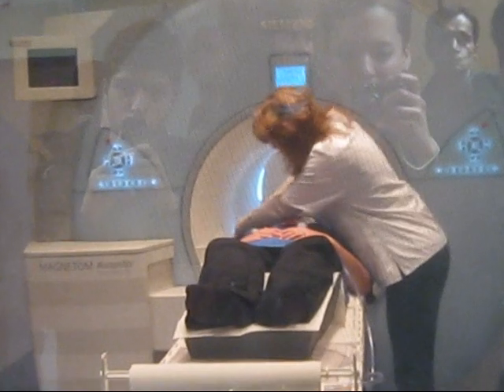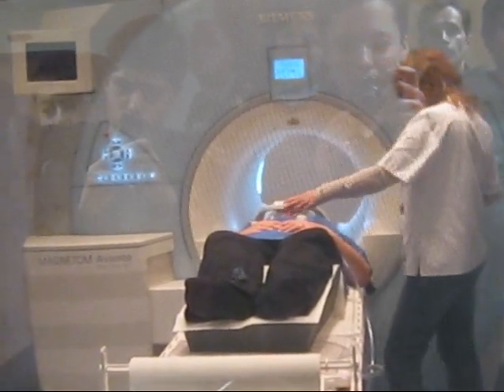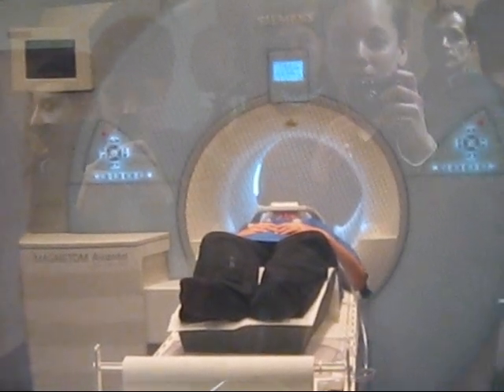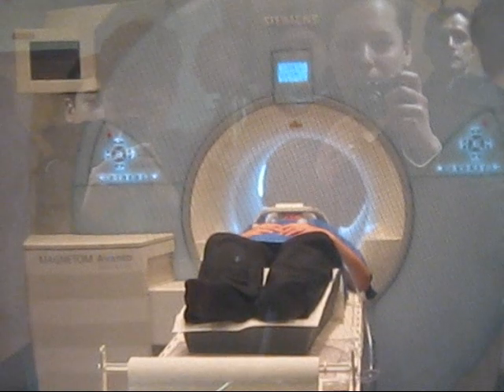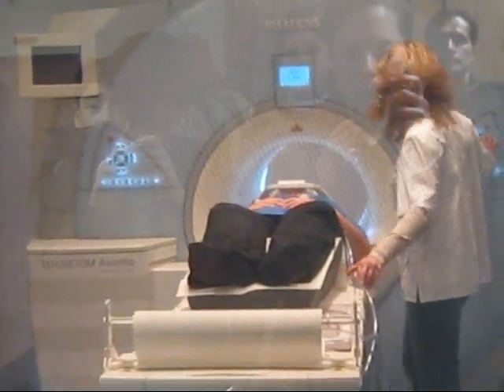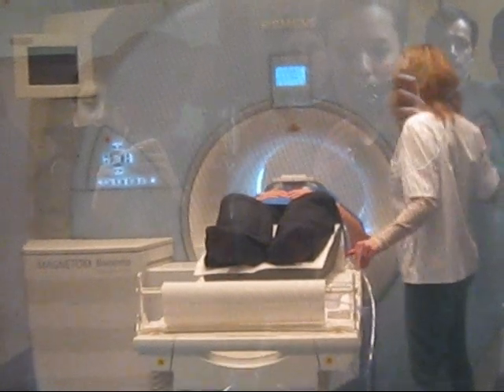The patient is now receiving an antenna that is placed over her cervical spine — the area that is to be examined. And now she is being put into the MRI.